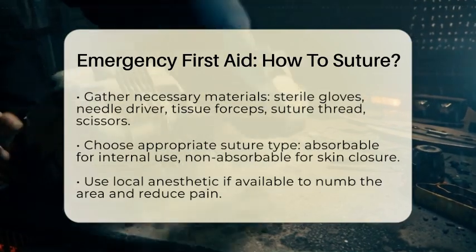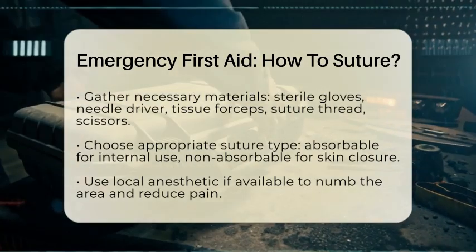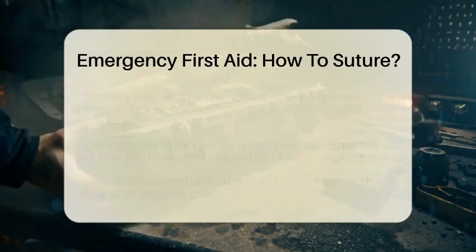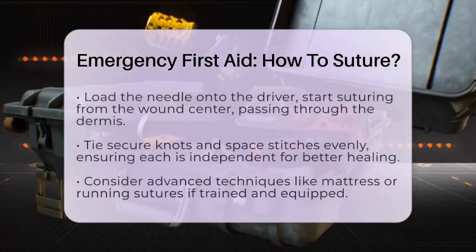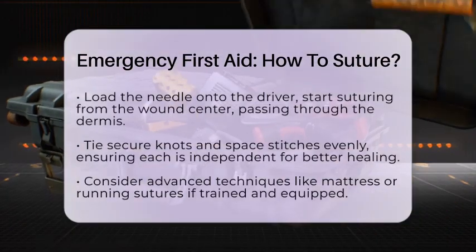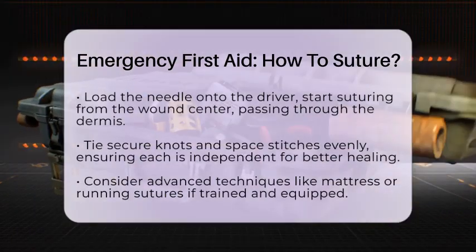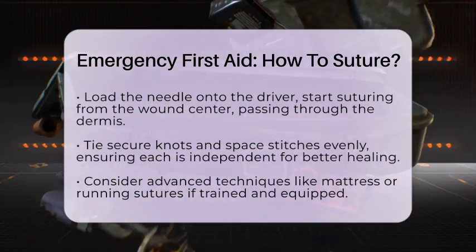When ready, load the curved needle onto the needle driver about 1/3 from the base. Start at the center of the wound to keep tension even. Hold the needle perpendicular to the skin and push it through about 1 centimeter from the wound edge, passing through the dermis but not too deep. Pull the thread through, leaving about 2.5 centimeters of tail.